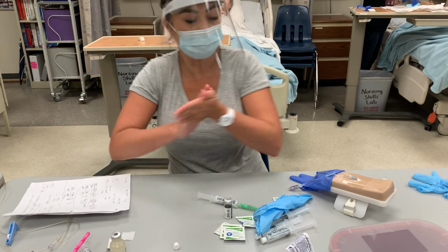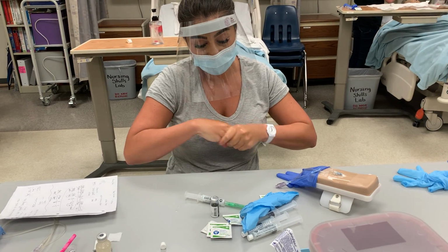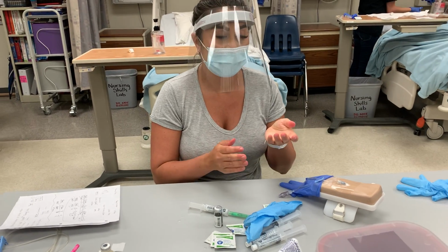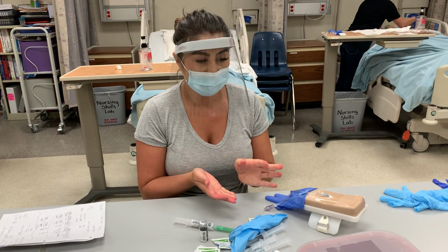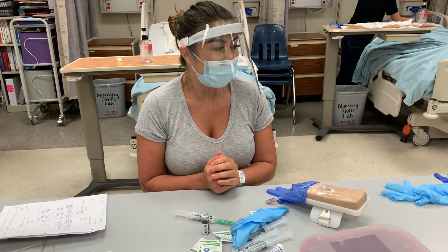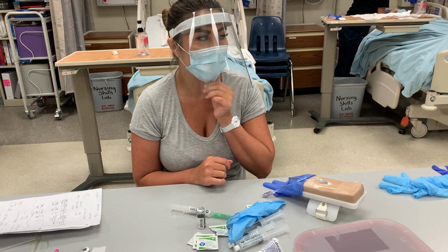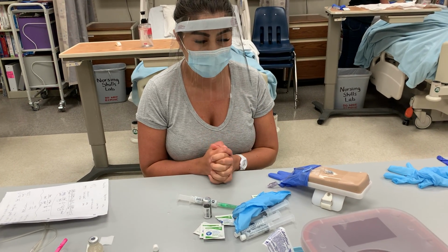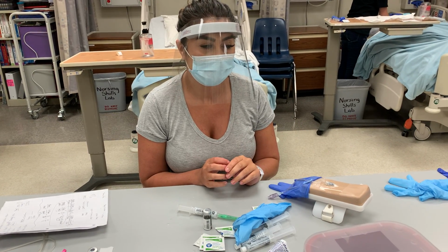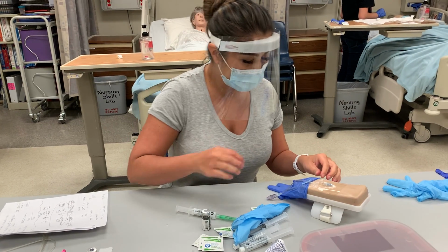I will do hand hygiene. Hi, Mr. Smith, I'm going to be administering some medication for you today. This is pain medication. Can you verify your first and last name, date of birth? Do you have any allergies to medication? Okay, good. And this is a pain medication, so can you tell me on a scale of 1 to 10, what is your pain? 10. Okay, and where is the pain? My back. Okay. All right, so we're going to go ahead and assess the IV site.